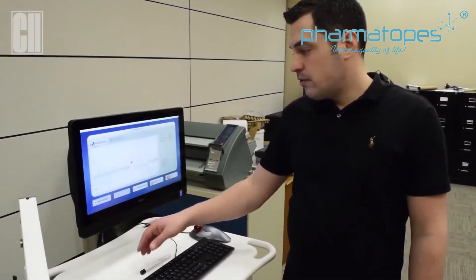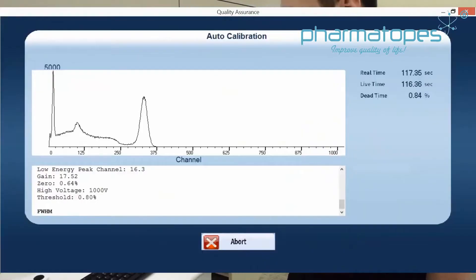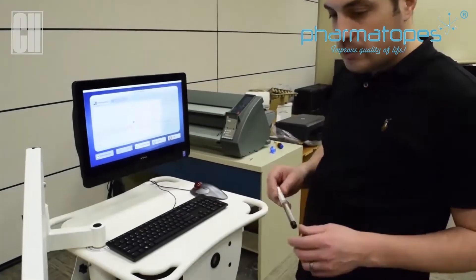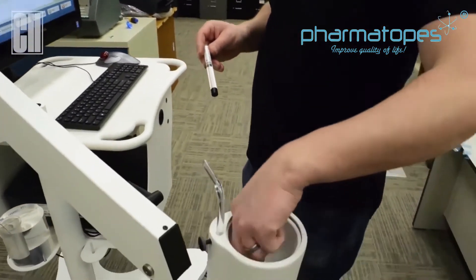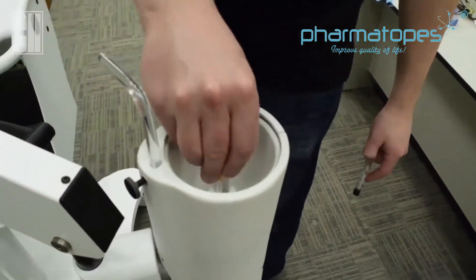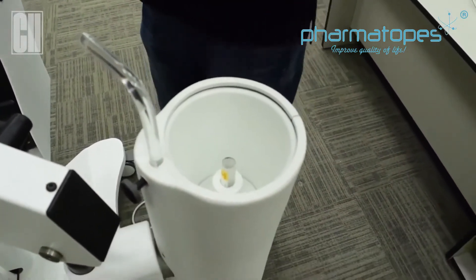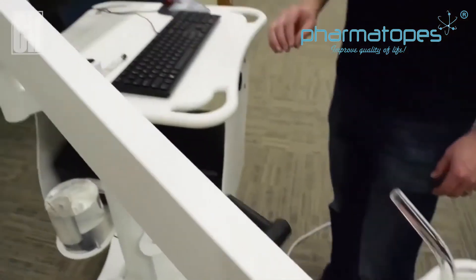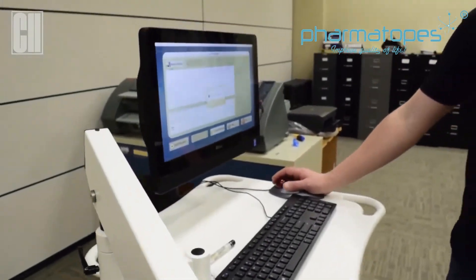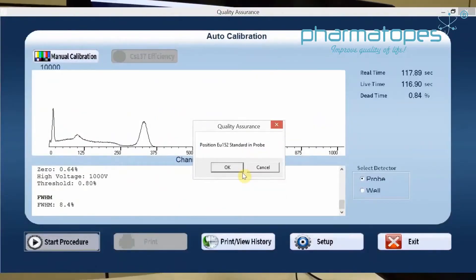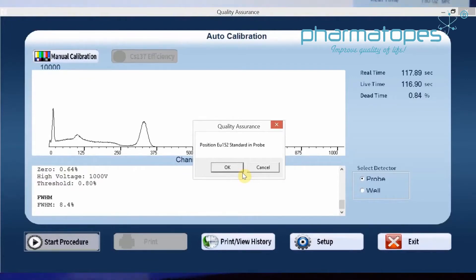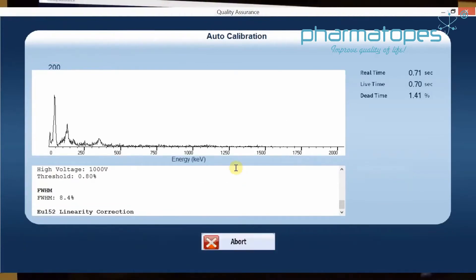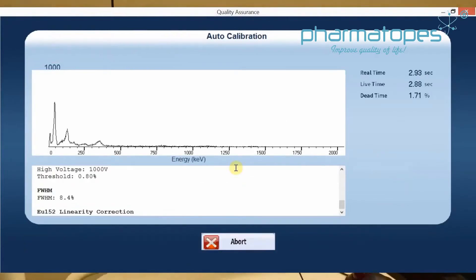Once the calibration is successful and it finishes with cesium, it will ask us to perform linearity with your europium source. Grab your europium source, remove the cesium, and place the europium source into the probe with the black tip down again. Once that's in place, click yes to perform the linearity. Once the source is lined up, continue on with the linearity, position the source into the probe, and click OK. That will calibrate our europium and give us a linearity result.